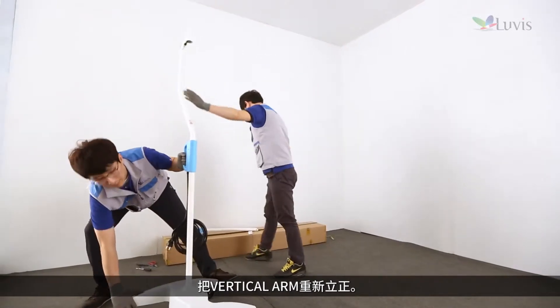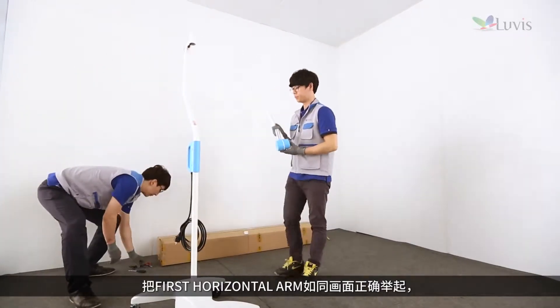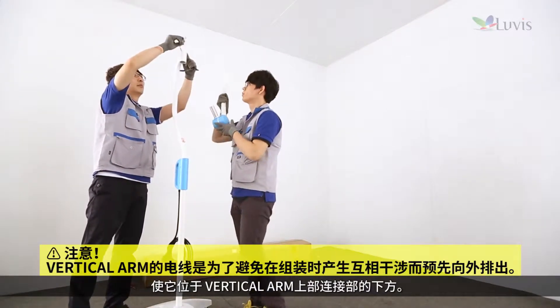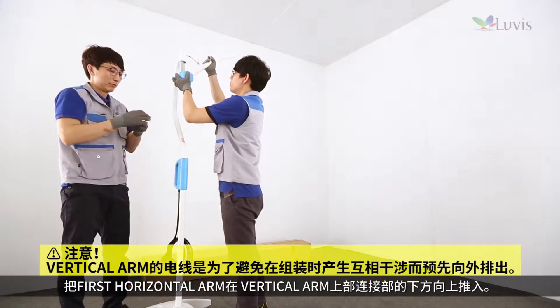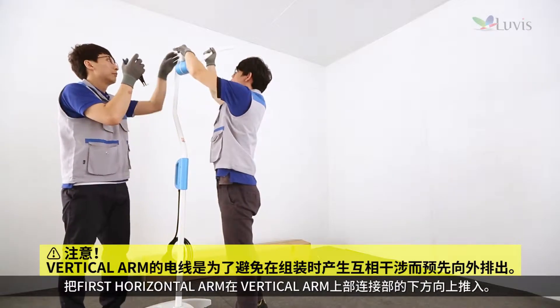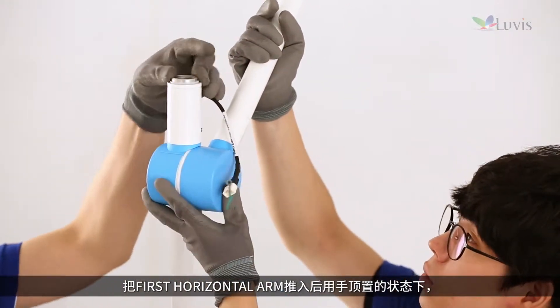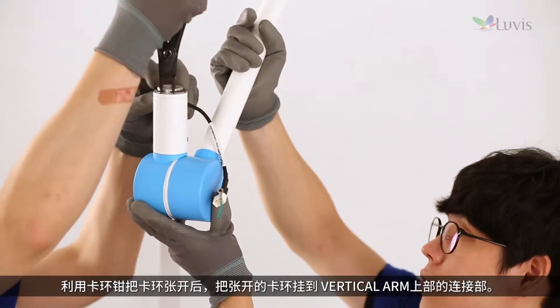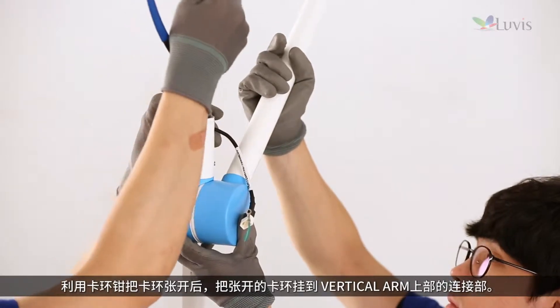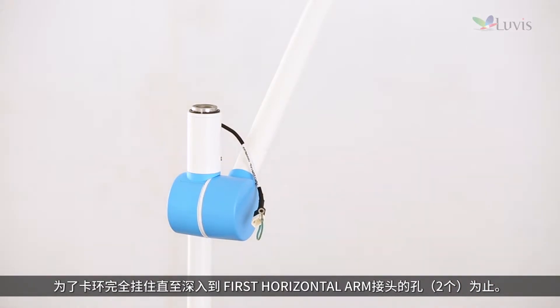Put the vertical arm straight again. Hold the first horizontal arm as shown on screen and locate it under the upper connection part of the vertical arm. Push the first horizontal arm all the way up from the bottom of the vertical arm's upper connection part. While opening a snap ring with snap ring pliers, hook the open snap ring to the vertical arm's upper connection part.